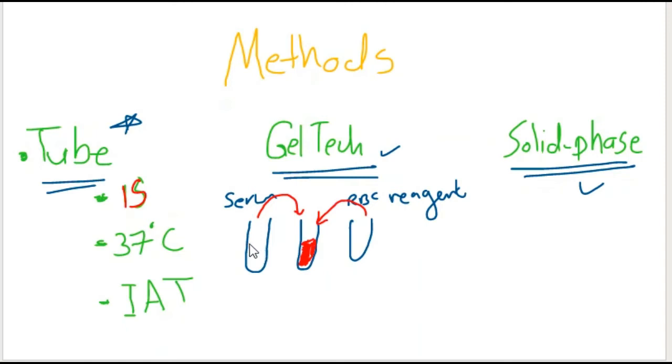In this case, if it's positive, this is an indicator that the antibody present in the serum is IgM, because there is no incubation time and there is no enhancement media. Why does it agglutinate? That means the antibody present is IgM, which is a complete antibody and can cause direct agglutination.